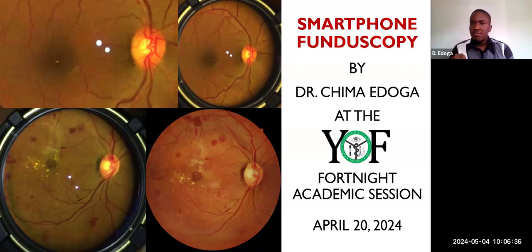And I also want to say that Peek Eye is direct ophthalmoscopy. It's a clip-on direct ophthalmoscope, so it's not indirect. It doesn't use the optics of an indirect lens like a plus 20D. I used it and it did not serve me, but the West Africa neurosurgery study that I mentioned in this presentation used Peek Eye, and it served him. He was able to image the optic disc in patients with head injury.